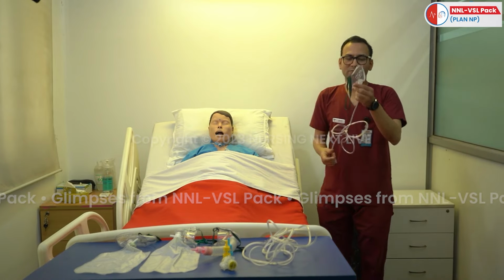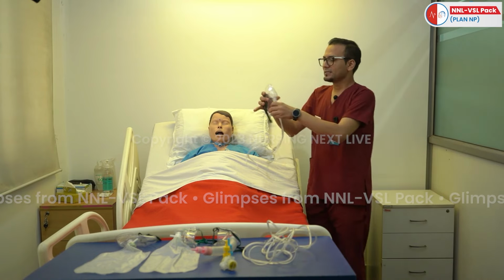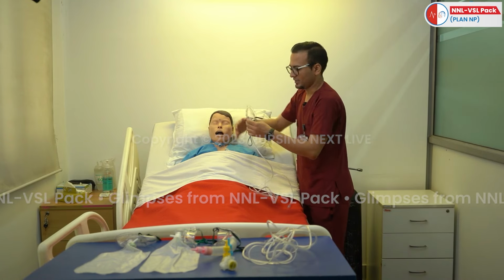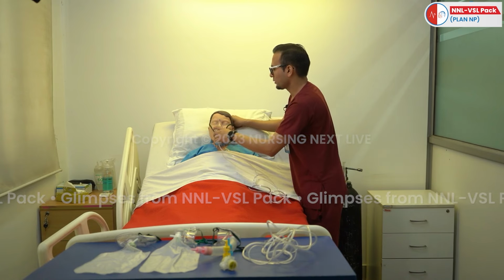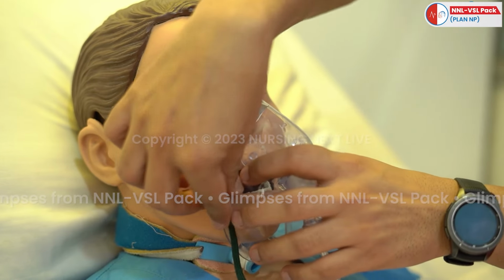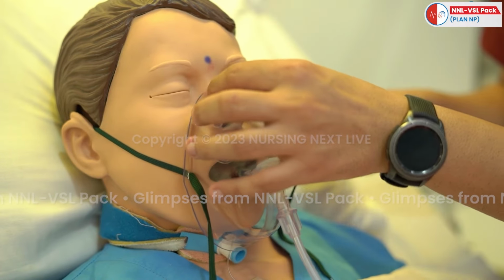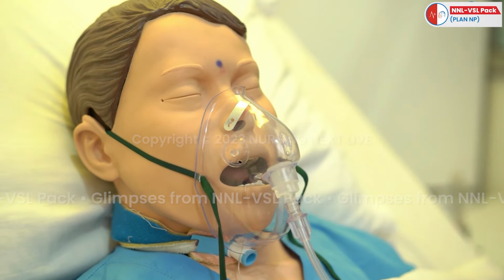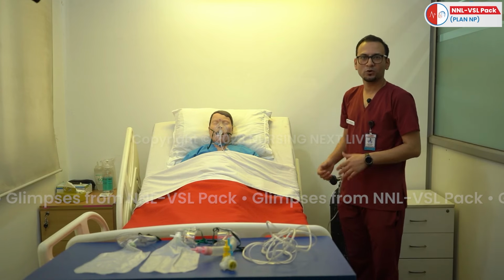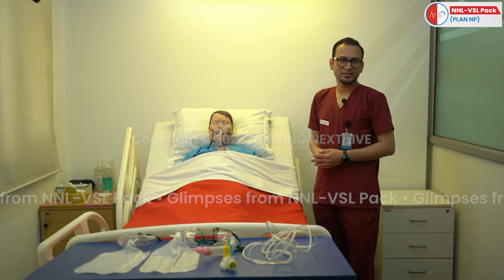So this is a simple face mask, and this simple face mask is basically a disposable plastic mask. This mask we are going to attach over the patient's nostrils as well as the mouth area. So like this, we can attach this mask over the nasal part as well as the mouth area. With the help of these ports, the patient is able to expel carbon dioxide. And this end portion we are going to attach to the oxygen cylinder. Either you can attach this port to the oxygen cylinder or to the central supply. And this simple face mask comes under the low flow oxygen devices.